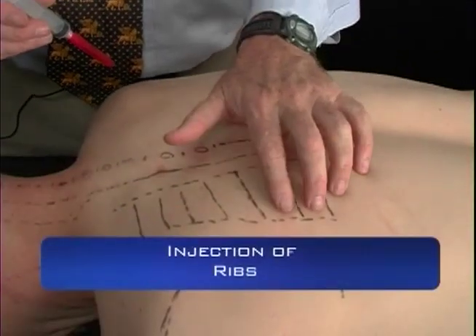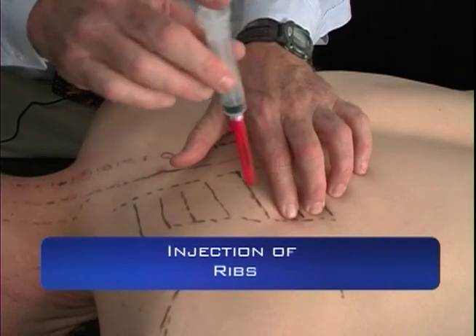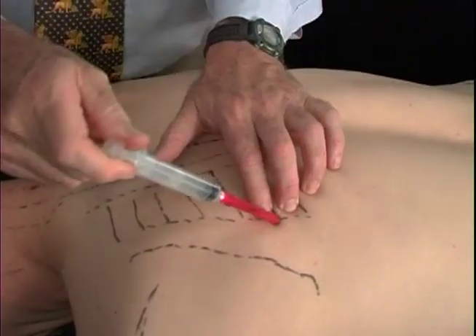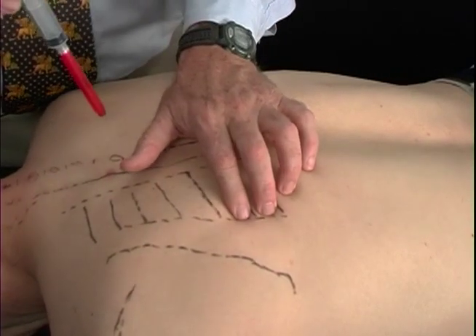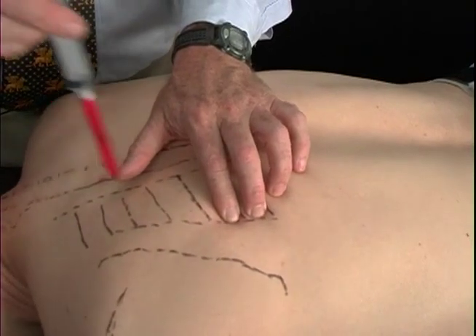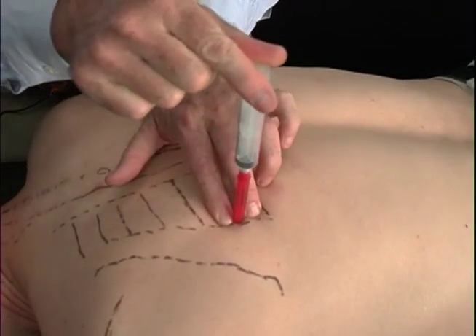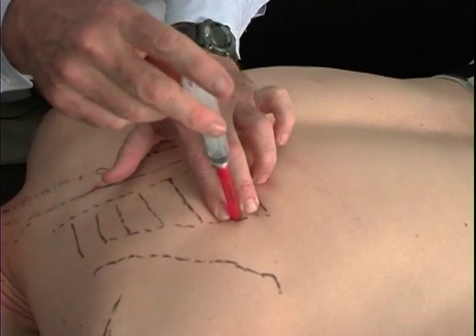So we want to start there, and we want to lock our fingers on the rib that we can feel, and then we come straight in. The injection is perpendicular, not with the needle bent one way or another, but rather straight in, perpendicular onto the rib, with a lot of skin compression down. You can turn your head if you want. Coming straight in, we hit the rib solidly and do our injection of 1/2 to 1 cc of our chosen solution.